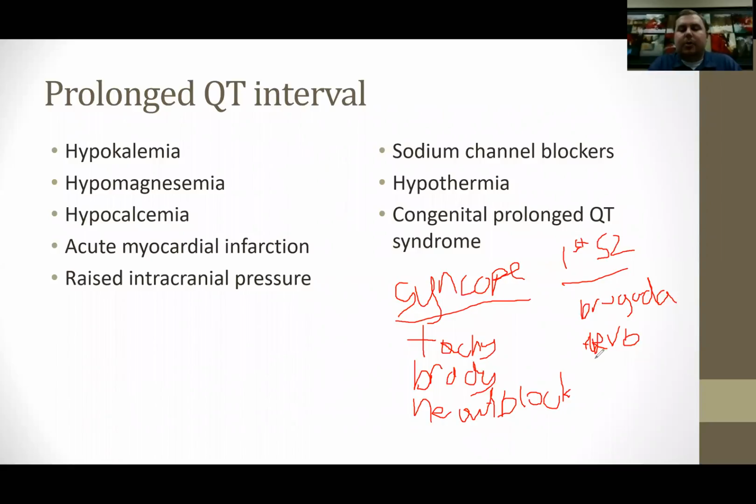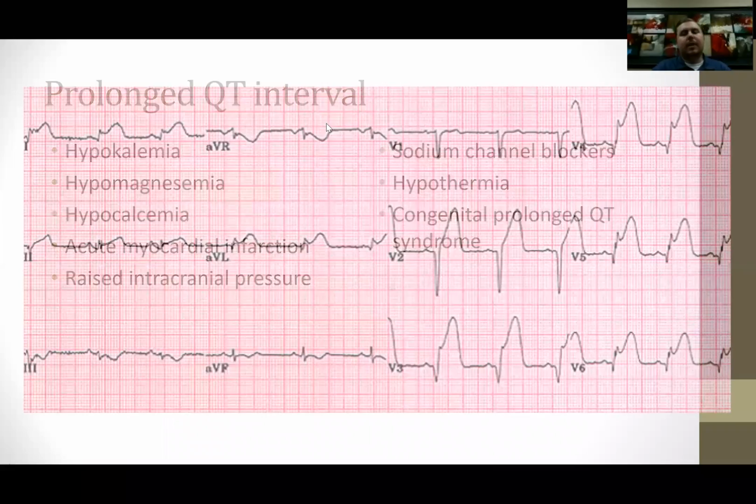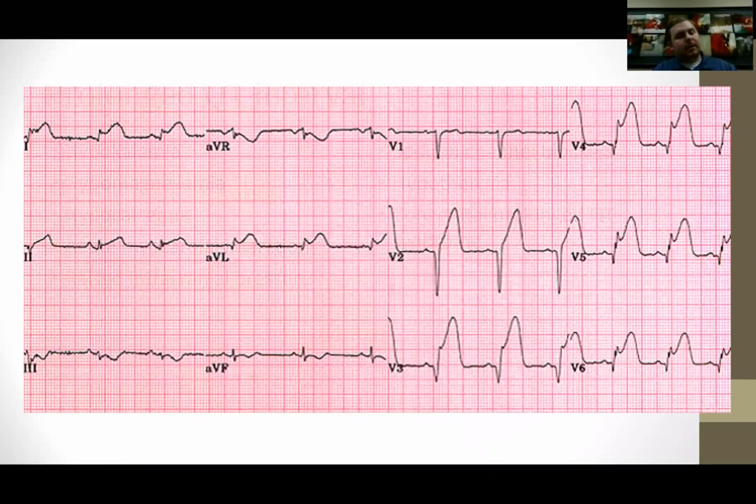Aside from that, hypertrophic cardiomyopathy is the next major one. So just know there's a different term out there for syncope that just has to be memorized, and you have to figure out what those different pathologies look like. All right, so finally we're on to practice. So we just have to remember the order that we're going to go in: rate, rhythm, axis, intervals, enlargement, ischemia.